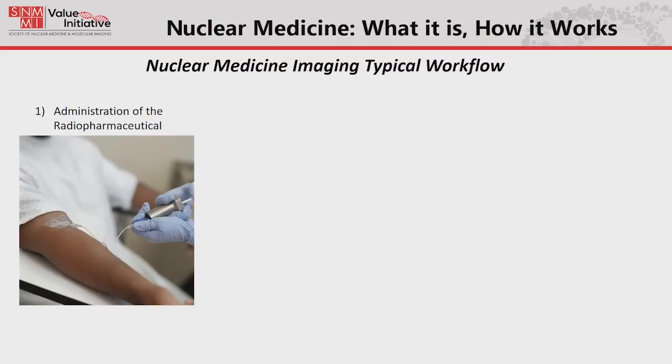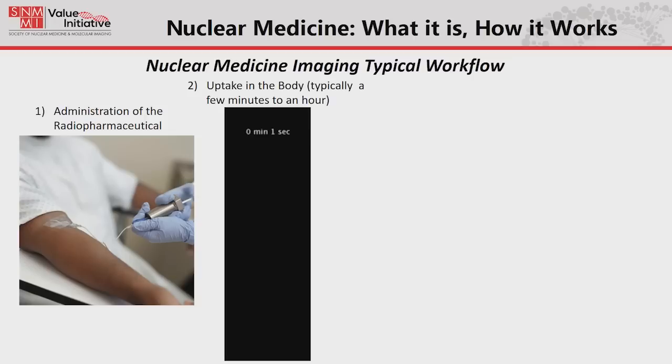The procedure is pretty simple. In general, we administer the radiopharmaceutical, 95% of the time by injection, but we do have other modes of administration. So I'm going to show you this. Some friends of mine worked with a company in China, and they built a PET scanner that's 2 meters long, so you can get the whole patient in there at the same time.